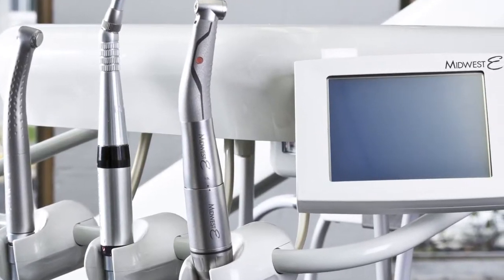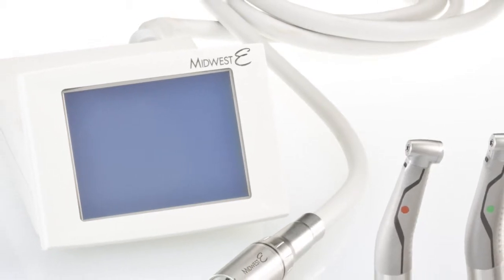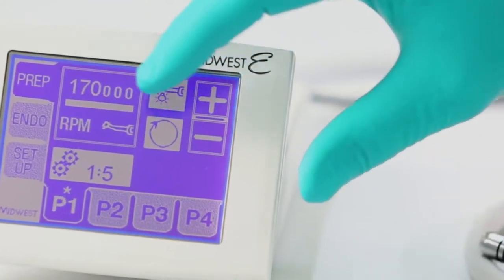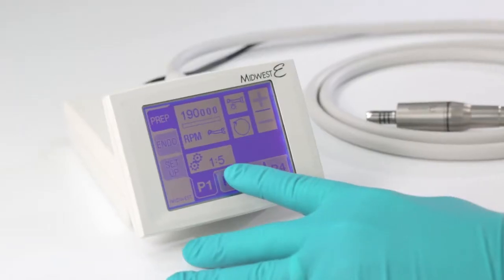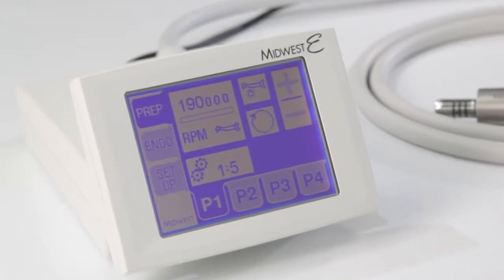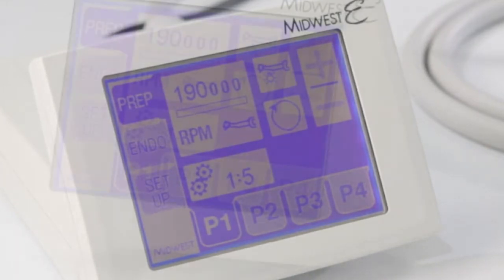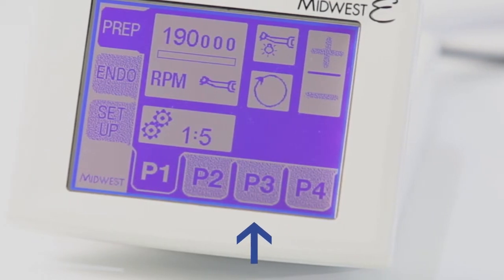Shown here is an installed Midwest E handpiece system. The components of the handpiece system are the touch screen control, the motor hose, and attached electric motor. The control allows you to adjust the settings of the motor, attachment, and display appropriate for your operatory and the current procedure. The touch screen control is arranged with tabs along the left side allowing you to select the operating mode — preparatory and endodontic — as well as the setup screen. Within each of the prep and endo screens there are four customizable presets.